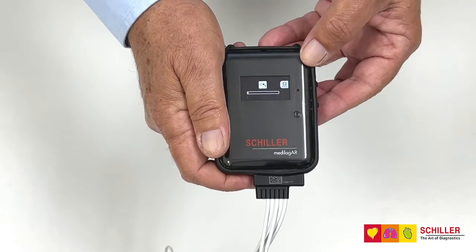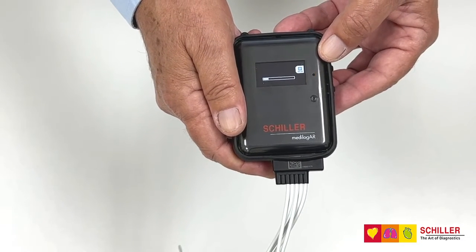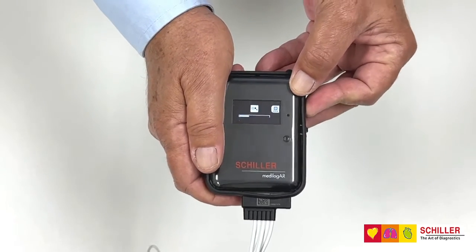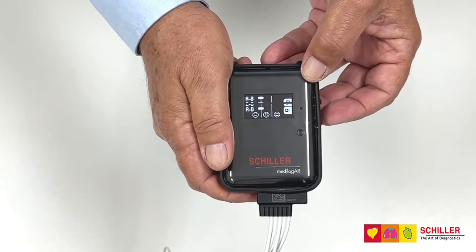Recording the ID will give you 40 seconds in which to record the patient name, date of birth, ID number, whatever you need in that moment. If you press stop, you can go to the signal quality evaluation.